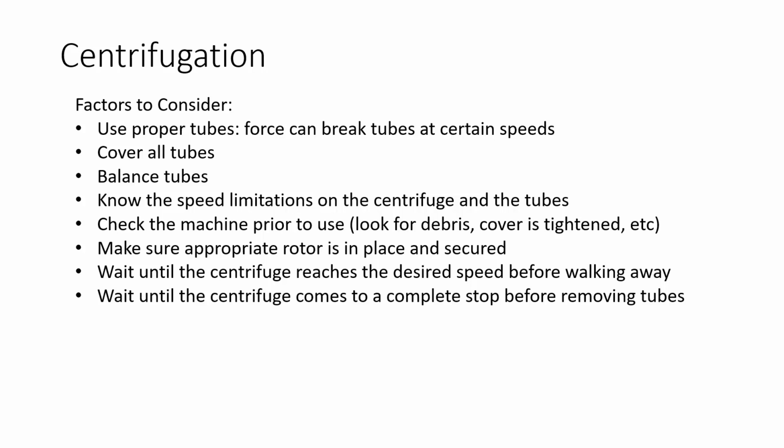Something else to consider that's not listed here is when you remove the tubes from the centrifuge, you want to practice caution so that you're not remixing the tubes after they're removed. So you want to be gentle and careful with them. And then typically once they're removed, they're going to be transported somewhere. So you, again, during that transport process, you don't want to be shaking the tubes, mixing them, allowing the rack to drop. If anything like that happens, you have to go through the centrifugation process again.